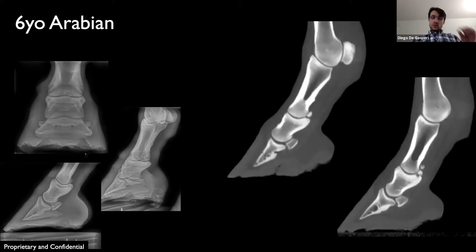We CT'd the horse and CT revealed bilateral fragmentation of the proximal palmar articular surface of the middle phalanx. The right side was more severely affected with multiple fragments, one of which was associated with a portion of the proximal palmar articular surface of P2.